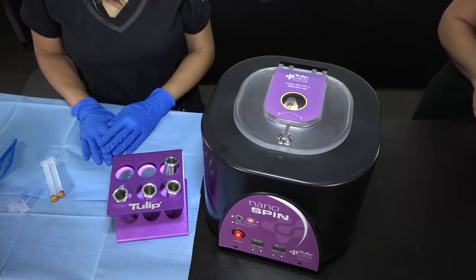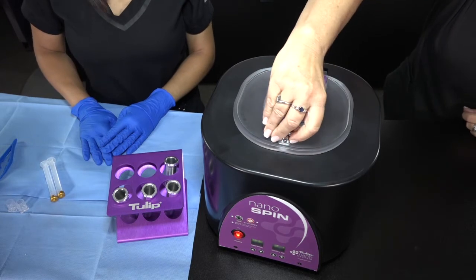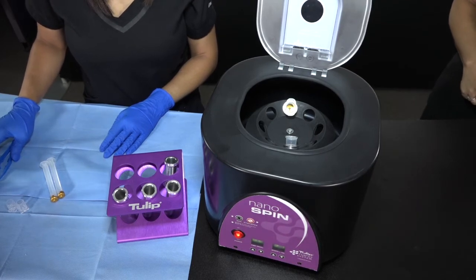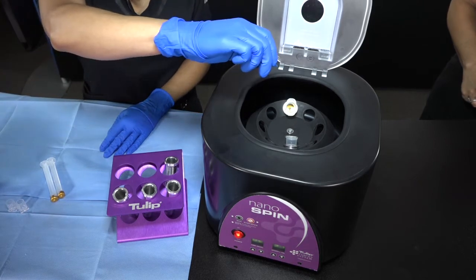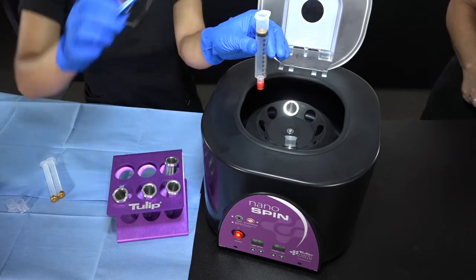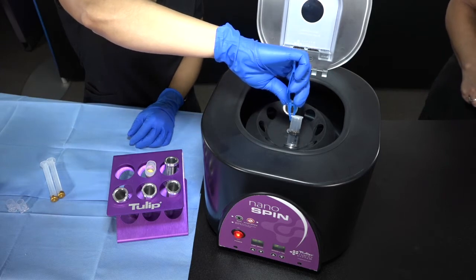The centrifugation is now done and processed. The unsterile nurse will open the chamber. The sterile person will then retrieve the spun graft, either with a forceps or hemostat, keeping sterility without touching anything black. Grab a forcep, simply lift up, and there's your graft. Put it into your sterile field.